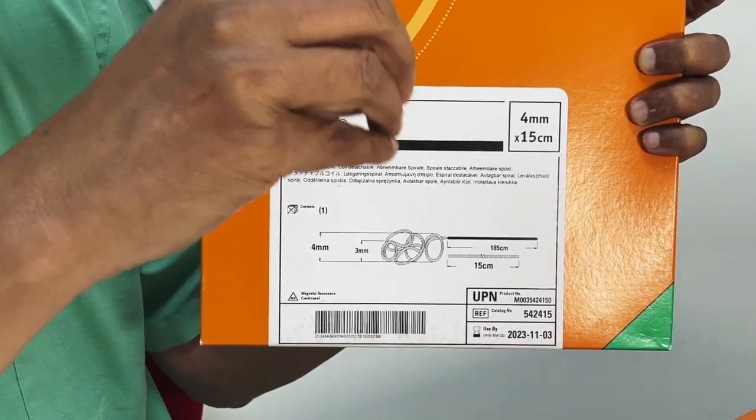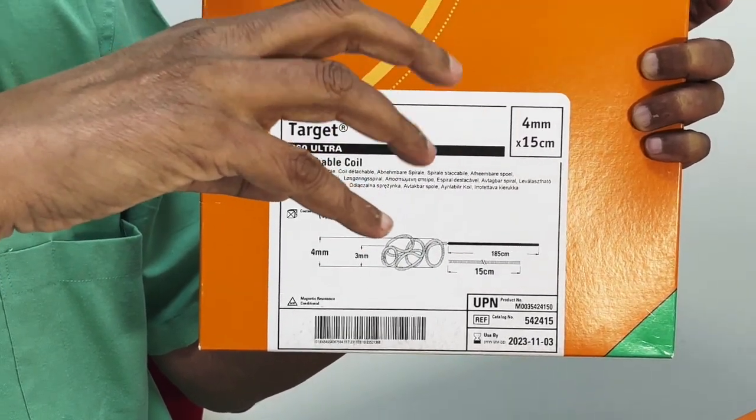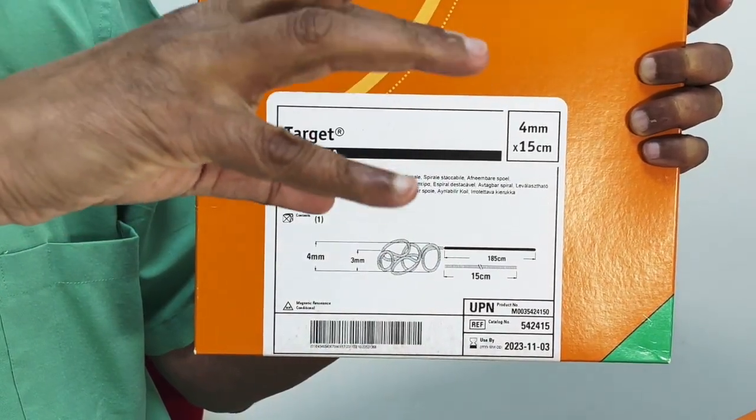Now, if it is going to be a multilobulated aneurysm, use shorter coils, because you will have a problem with the coil actually going into all the lobes.